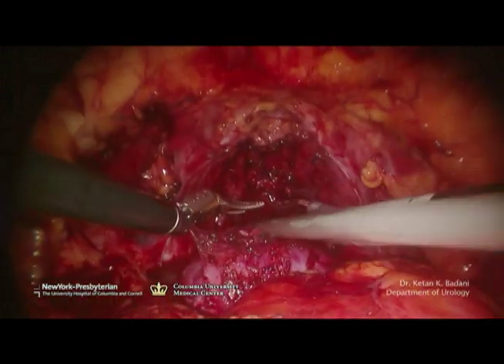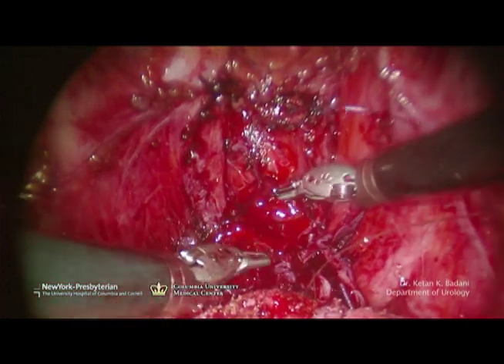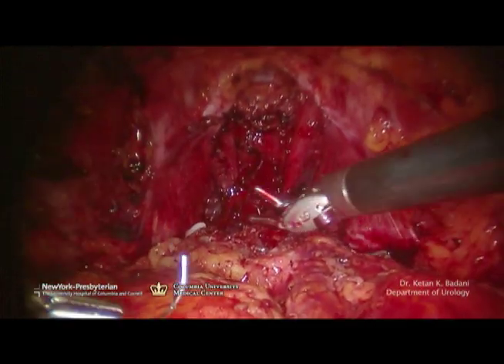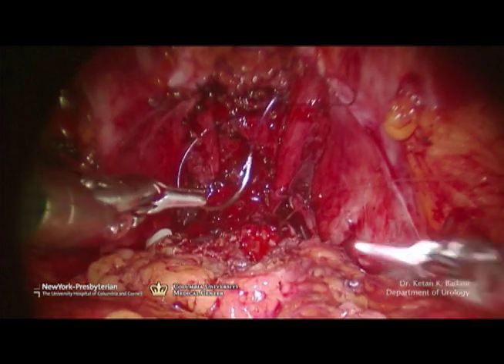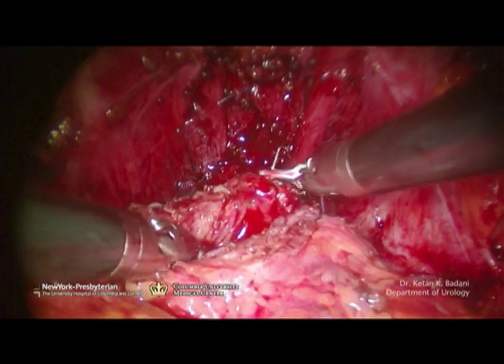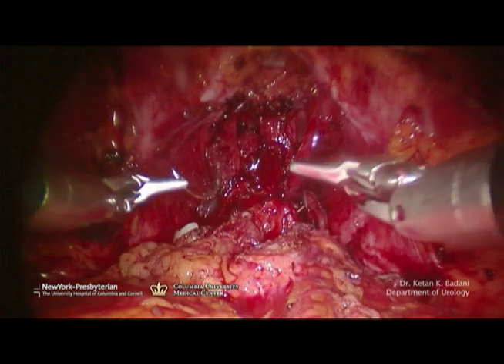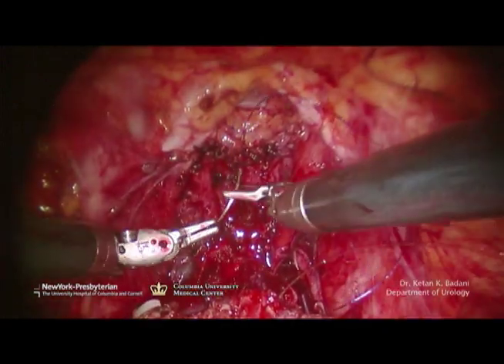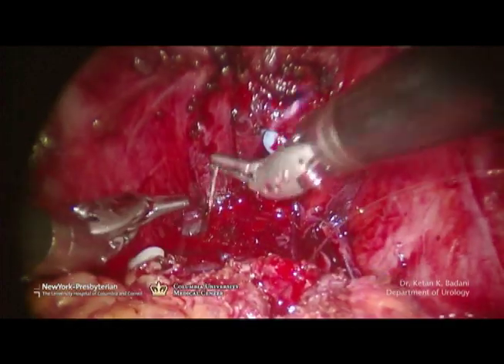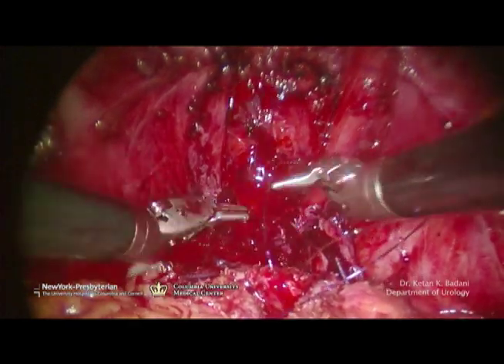The specimen is now free, and the anastomosis has begun. Here we employ the same 3-0 monocryl on an RB1 needle, dyed and undyed, tied together. A bite was already taken on the posterior bladder neck and the urethra. This is the second bladder neck bite — full thickness — and the second posterior urethral bite. The first bite taken at 5 o'clock on the urethra and the second bite taken at 6 to 7 o'clock, encompassing all of this posterior urethral tissue.